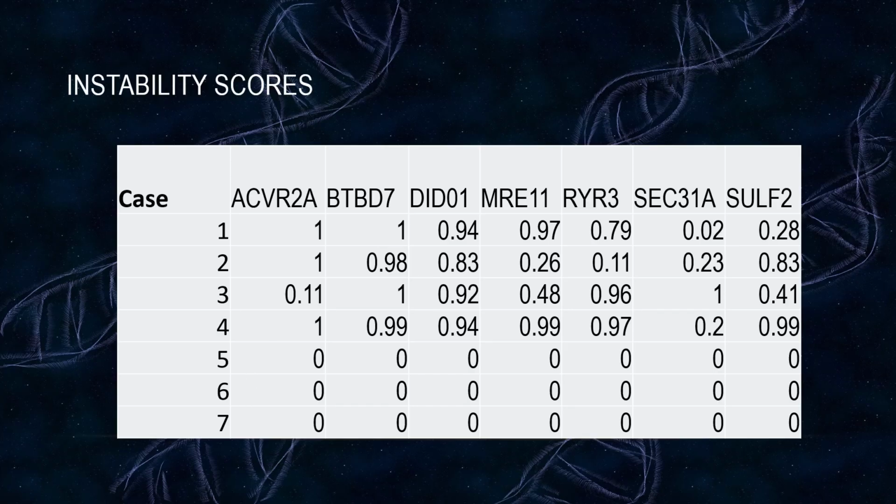So again, since I brought it up, main advantage is it's a lot faster than other assays. Disadvantages, it was developed in colon cancer, and it has a little bit weaker sensitivity in other tumors like endometrial, but when we were validating and studying it, we found that by adjusting some of the thresholds, you can actually catch a lot of those false negatives and make them true positives, or at least make an indeterminate category and improve the results there, but won't go into detail on that.